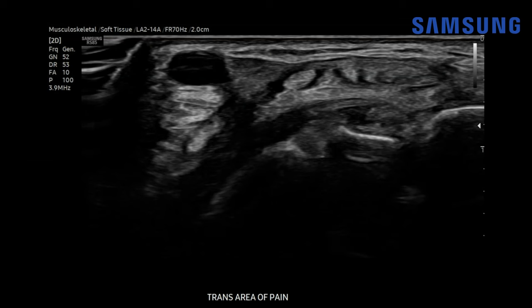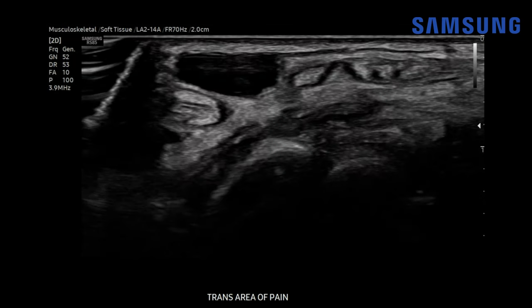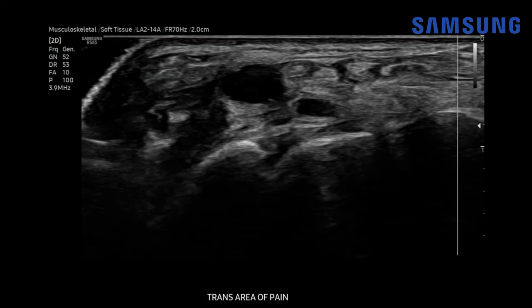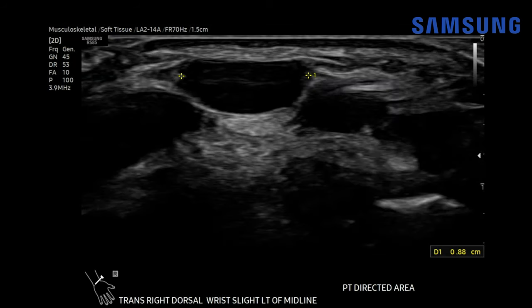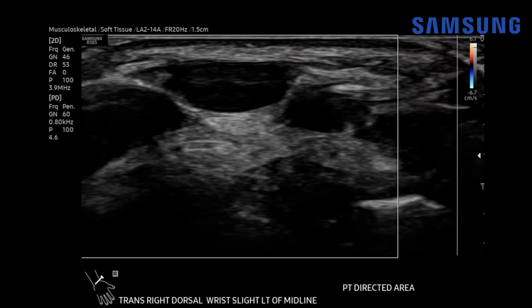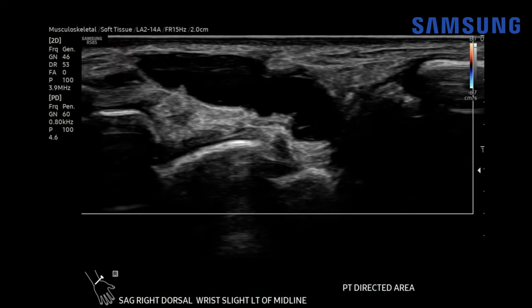Now let's turn transverse. Here's the cystic structure, and we notice that it's adjacent to the fourth compartment of the dorsal extensor tendons. As we move distally, notice this posterior acoustic enhancement because it's a fluid-filled structure. It's going more deeply towards the joint space the more distal we get. It measures about nine millimeters on transverse images. When we add color Doppler flow, we don't see any internal vascularity, transverse or sagittally.